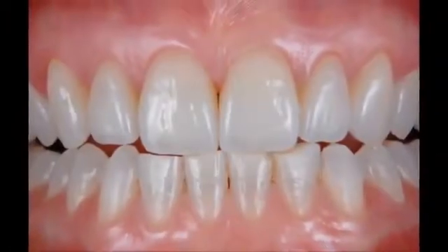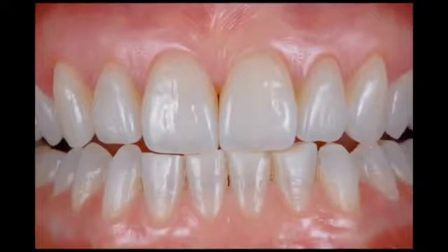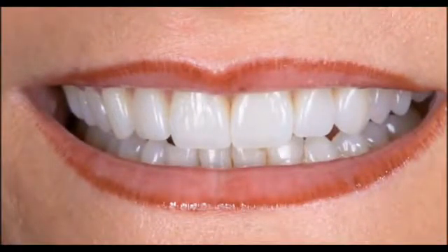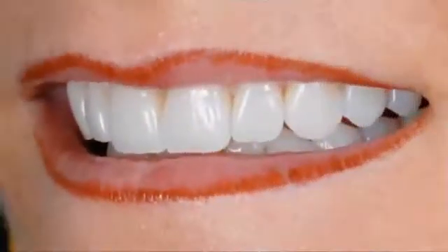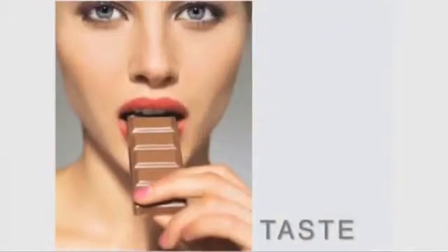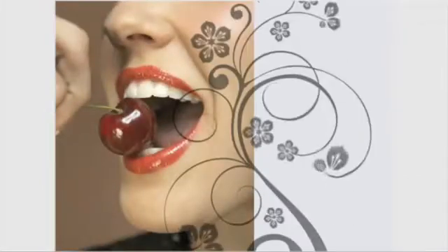With this technique the patient can be aware of the aesthetic outcome and can interact with the clinician during the treatment plan. Previsualization is crucial to provide an extremely conservative preparation with calibrated and sufficient reduction to efficiently build the restoration. In addition, it serves as a guide for the technician during the fabrication of the final restoration.